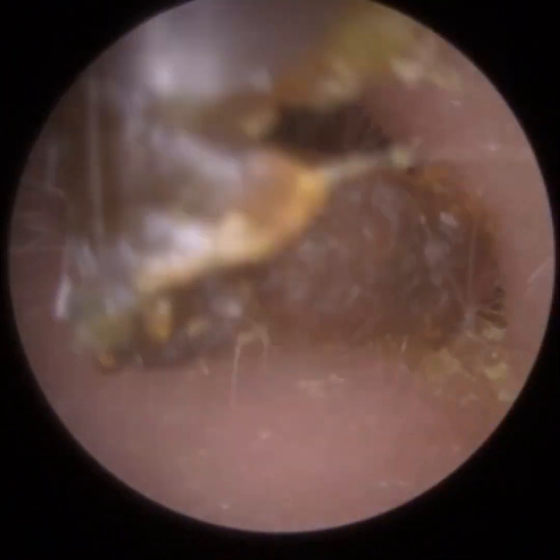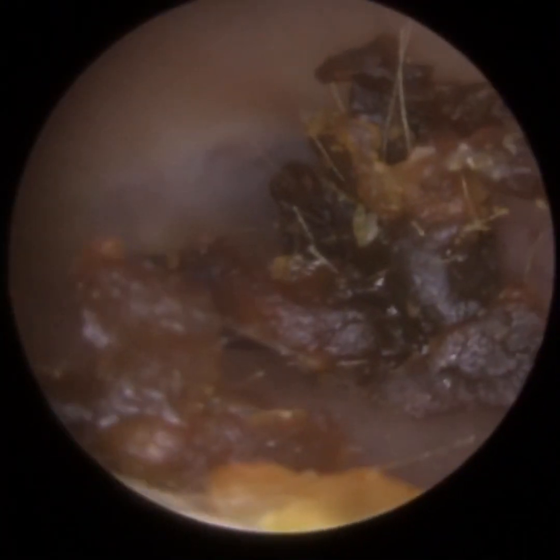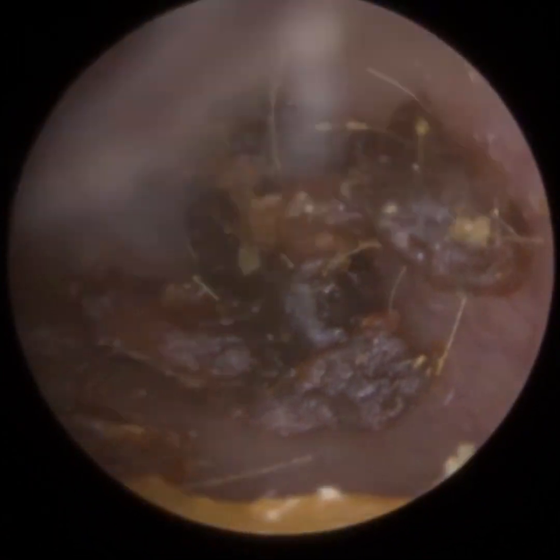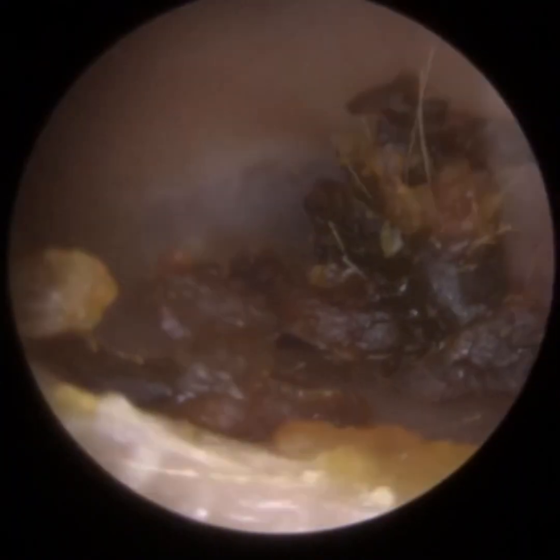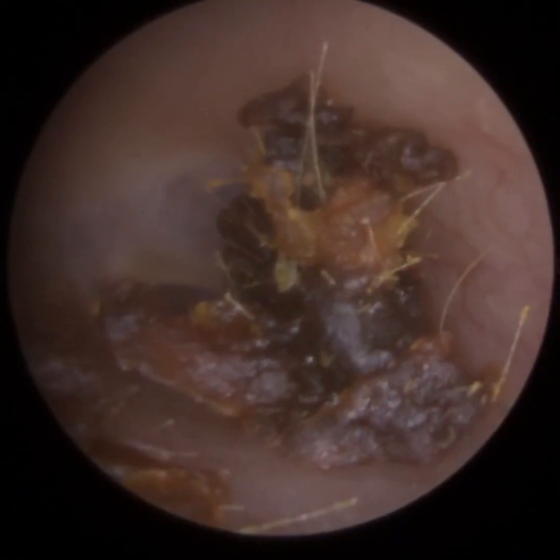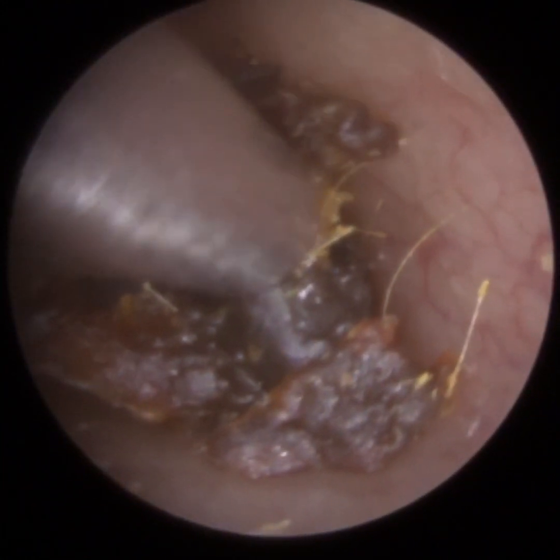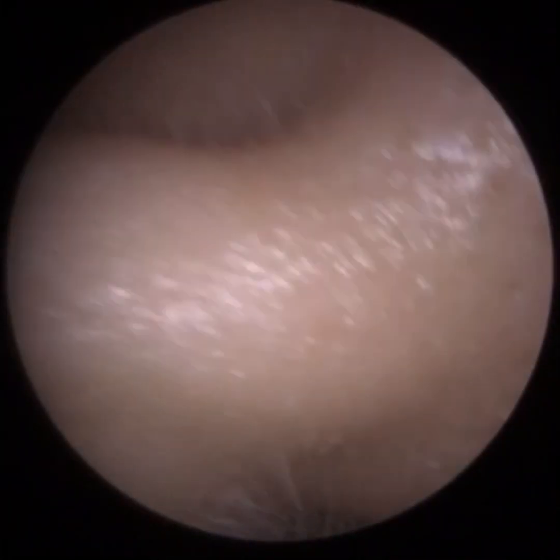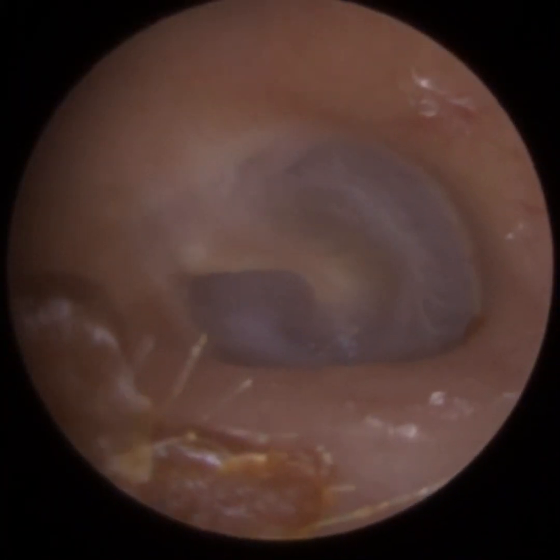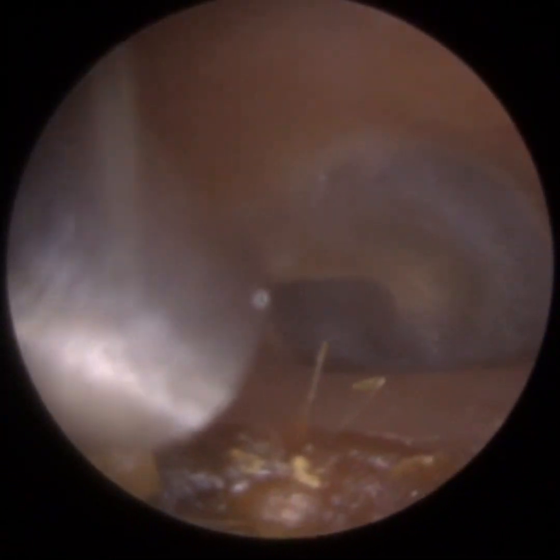Slowly but surely, we're just wriggling out this dry wax. This type of wax — because it's got a rough surface — when the patient talks or chews, it can rub against the canal wall. When you move your jaw and open it, your ear canal widens up to the second bend, so about a centimetre into the ear canal — the cartilaginous portion. And when you really clench your jaw, you almost somewhat contract your ear canal, you narrow it. So when the patient talks or chews, the ear canal going up and down can be rubbing against the surface of this dry wax, which can be a bit uncomfortable for the patient.